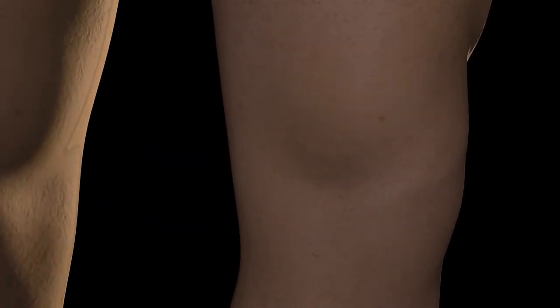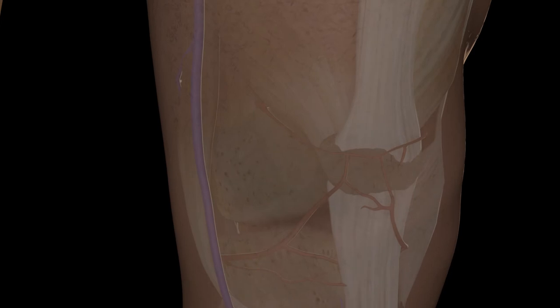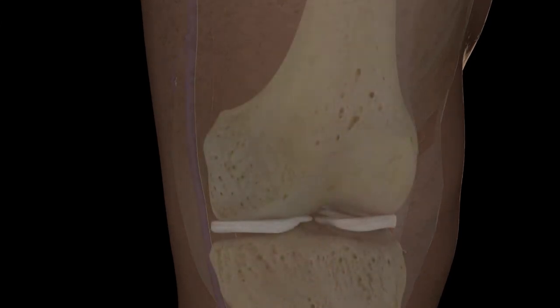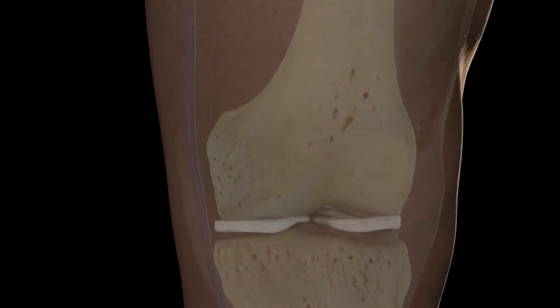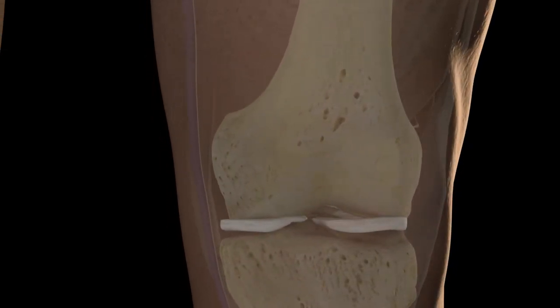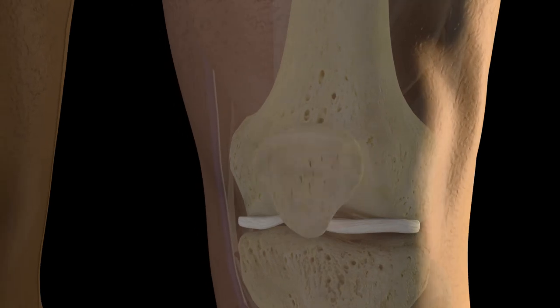The knee includes the condyles of the distal femur, proximal tibia, and the head of the fibula. Anterior to these structures is the patella.